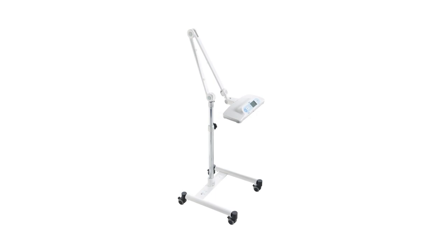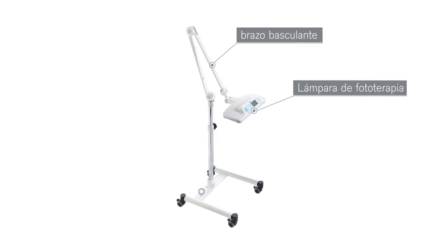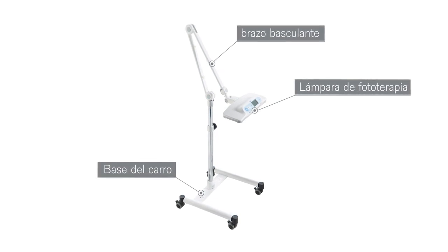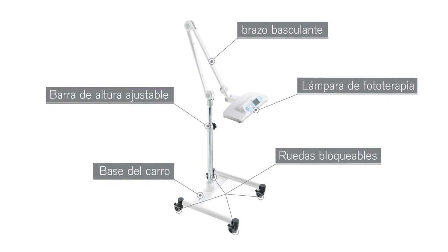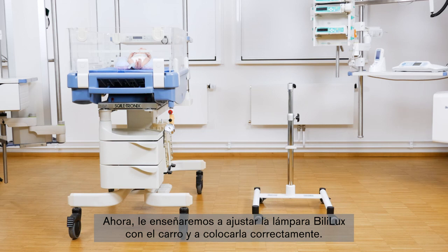The Bililux with trolley consists of the phototherapy light, an adjustable spring arm, and a rolling trolley that allows flexible use above an incubator, radiant warmer, crib, or bassinet. The trolley itself has four locking casters and a height-adjustable pole.